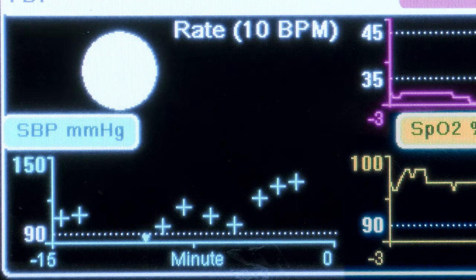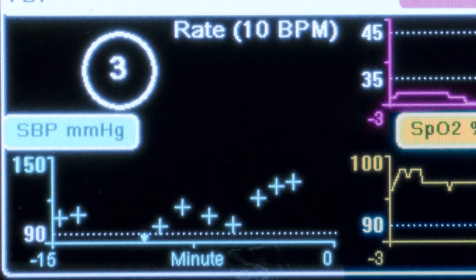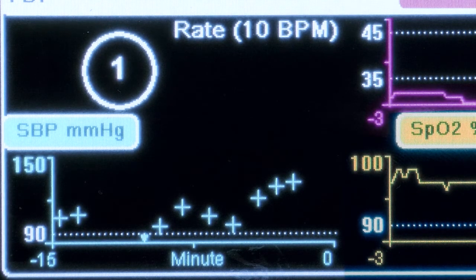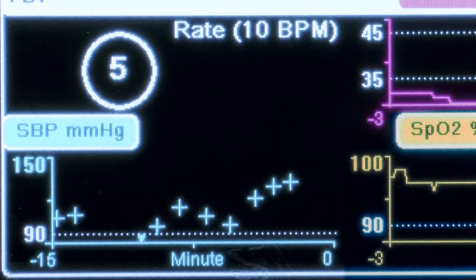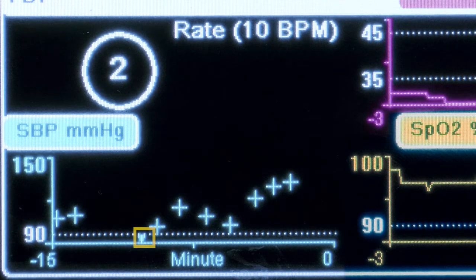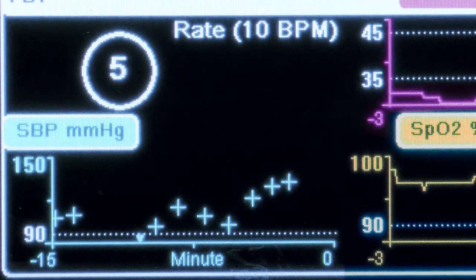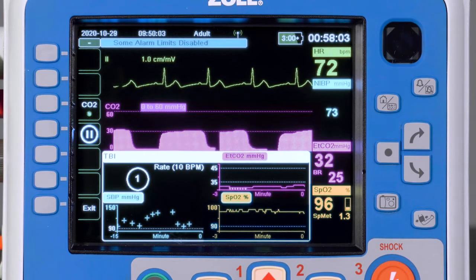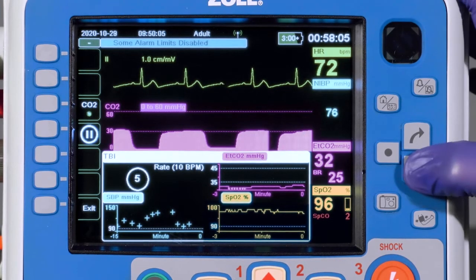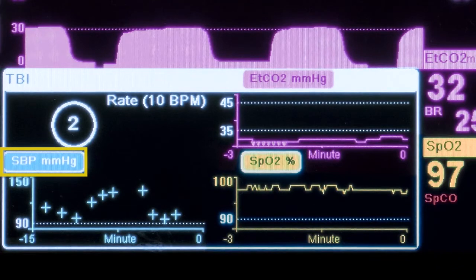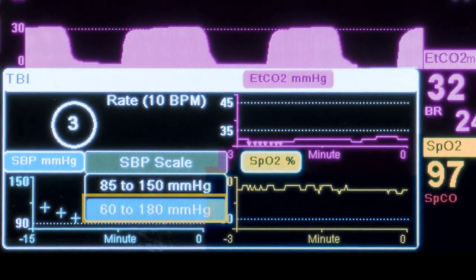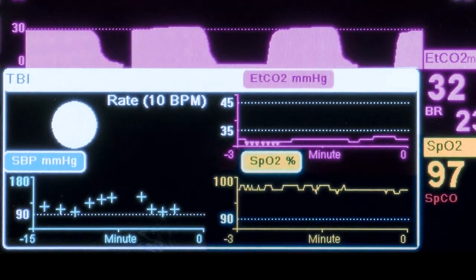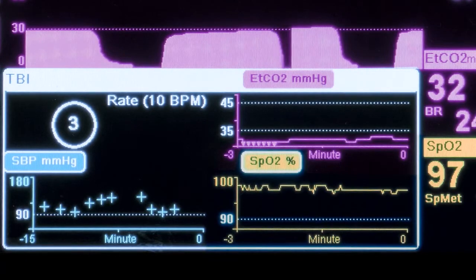The supervisor-configured low systolic pressure limit is only available in the adult patient mode. Systolic blood pressures that fall outside of the viewable range will be shown with either an arrow pointing up at the top of the graph, meaning it is above the viewable range, or an arrow pointing down at the bottom of the graph, meaning it is below the viewable range. It is possible to rescale the graph by highlighting SBP mmHg, pressing select, selecting the wider 60 to 180 mmHg setting, and pressing select again to confirm.